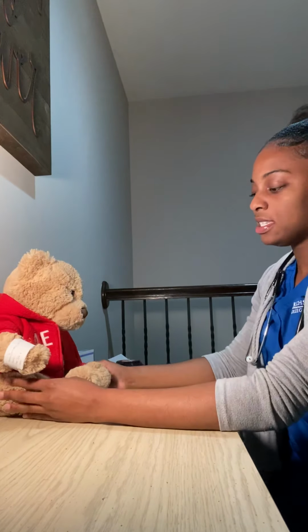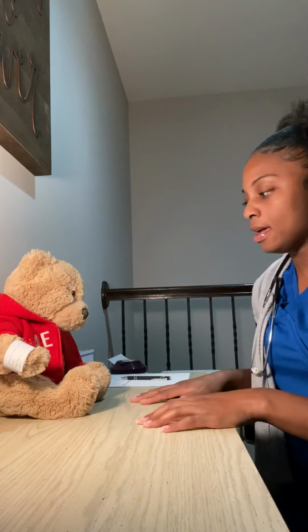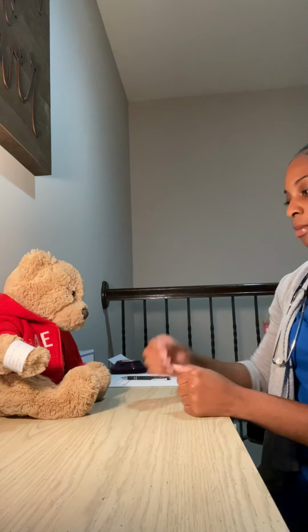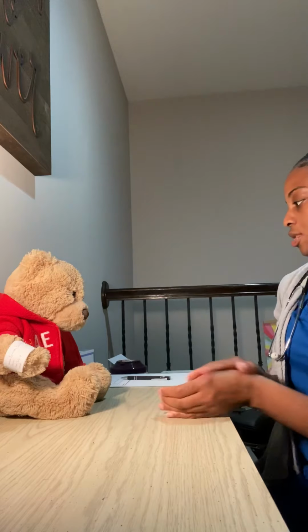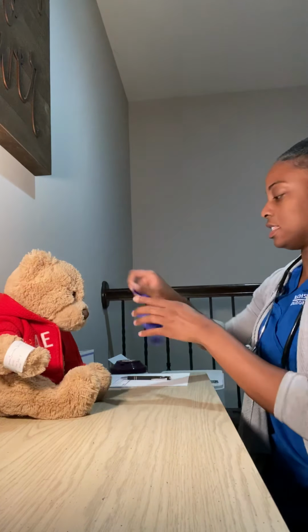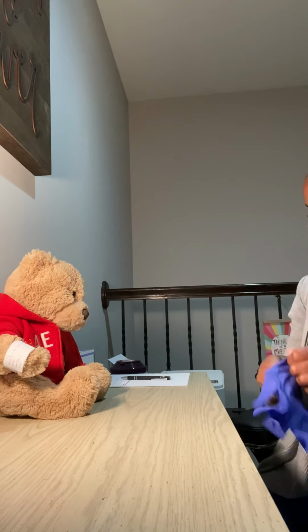She has MS and she's bedridden, so I know that she cannot move, that she cannot get out of bed, but she's alert and oriented and is able to respond to me with some difficulties, being that she has a trach. She also has a PEG tube, and we're gonna do our videos on that later. Okay, I'm gonna go ahead and start. I'm gonna start with doing my vital signs first. That's usually the first thing we do when the patient gets to the floor.